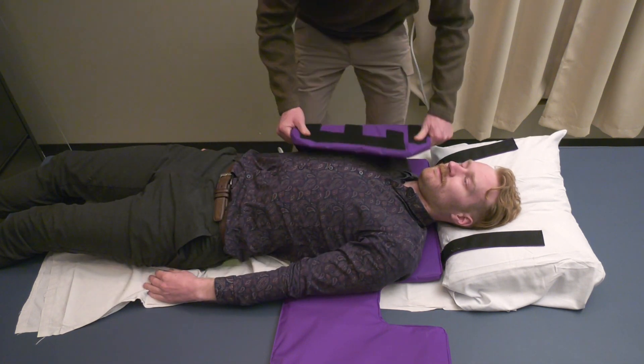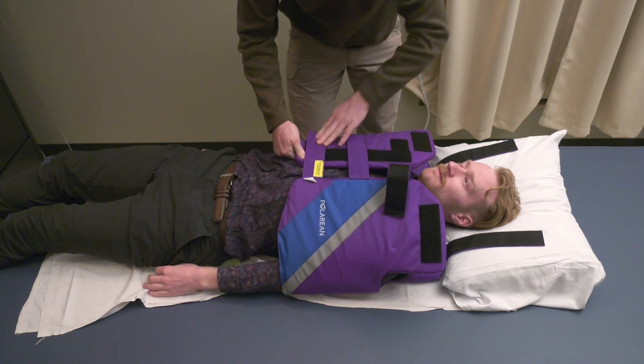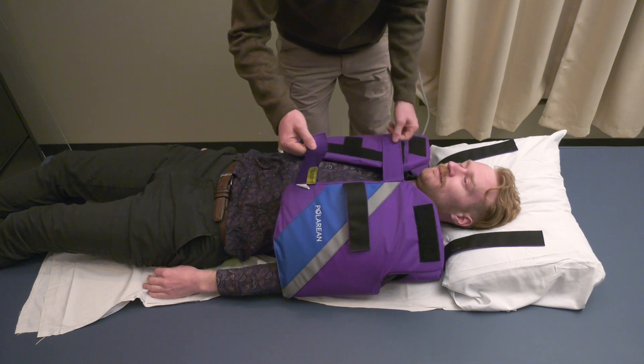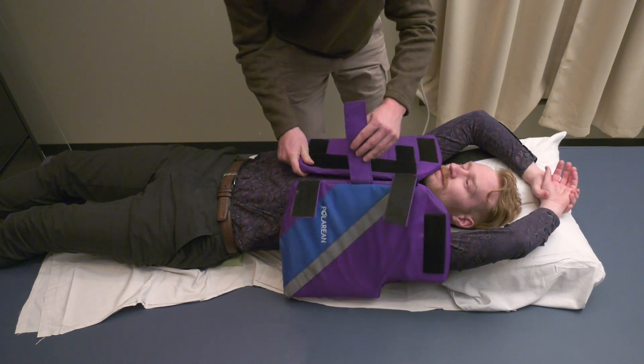The vest works best when it is wrapped all the way around the research participant with arms inside the vest. If the vest is too small for this, the research participant may need to hold their arms above their head during the MRI.